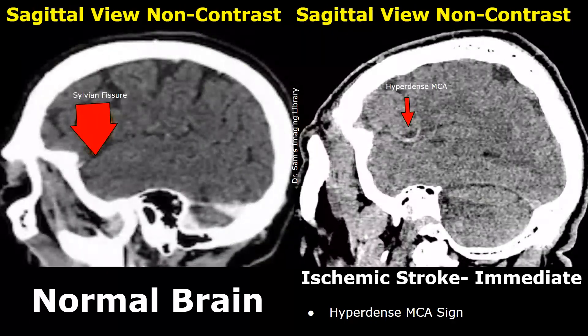These are sagittal views of the brain. Here we can see a hyperdense MCA. In immediate stroke, it is at the location of the sylvian fissure.